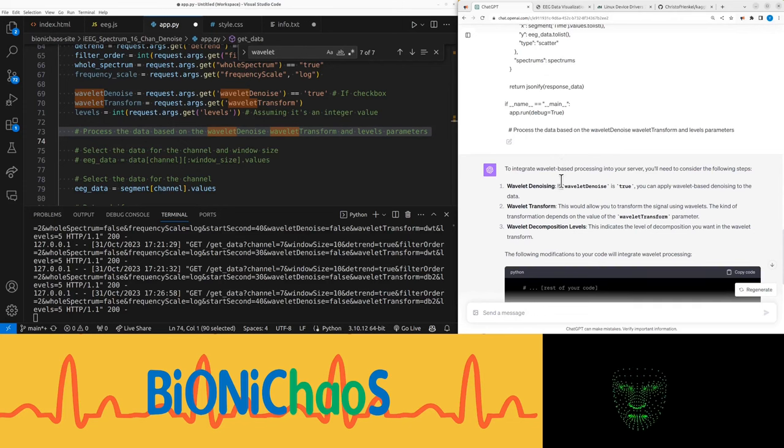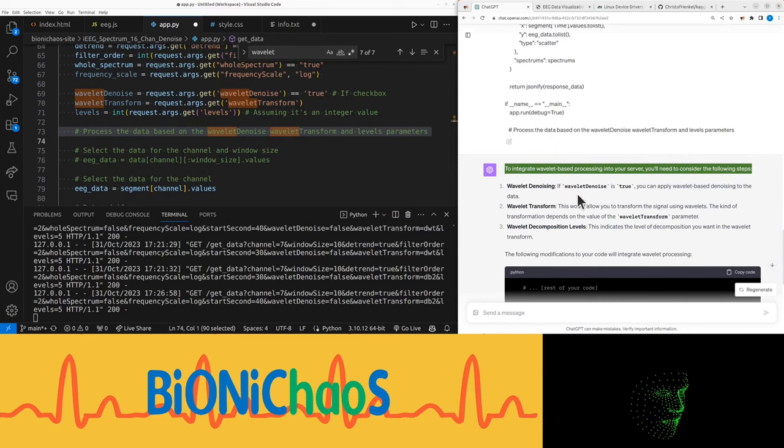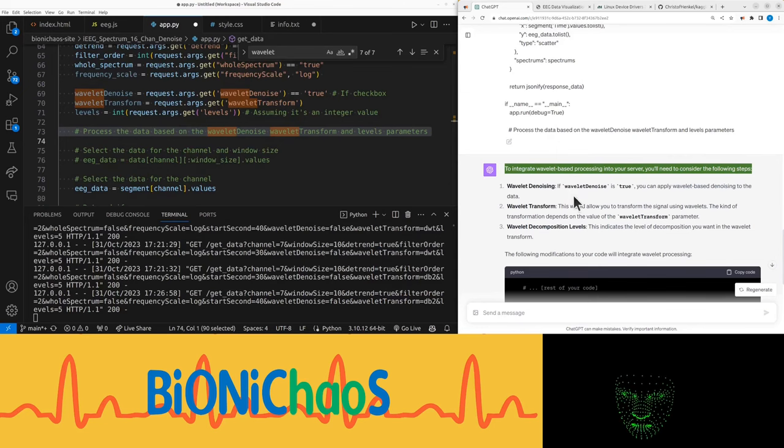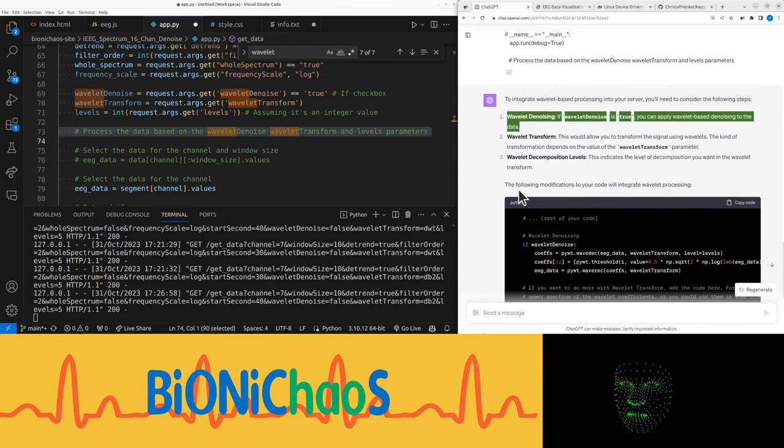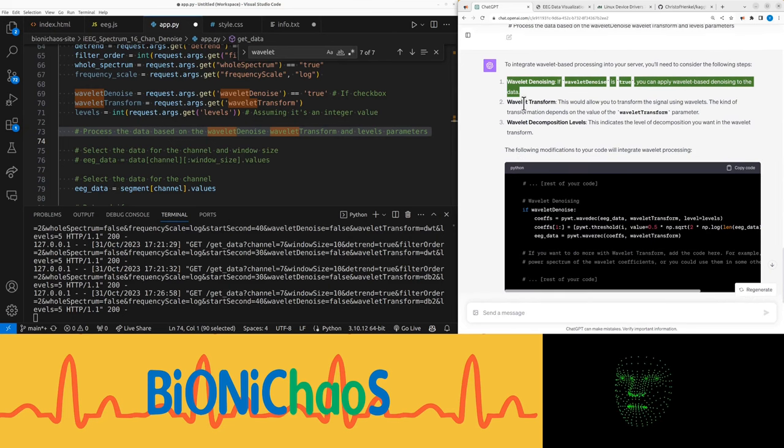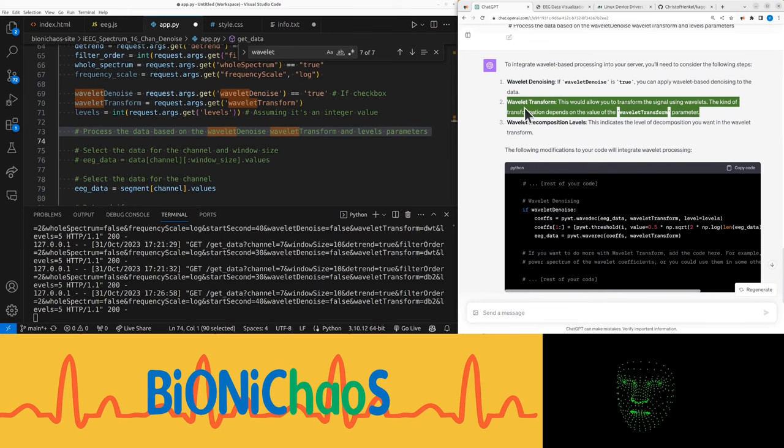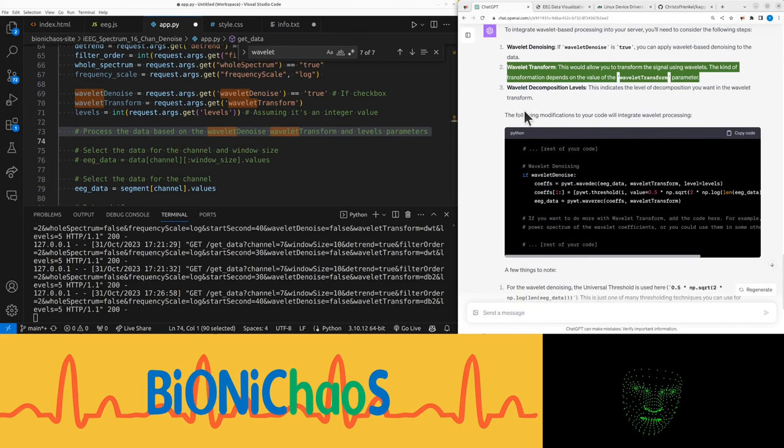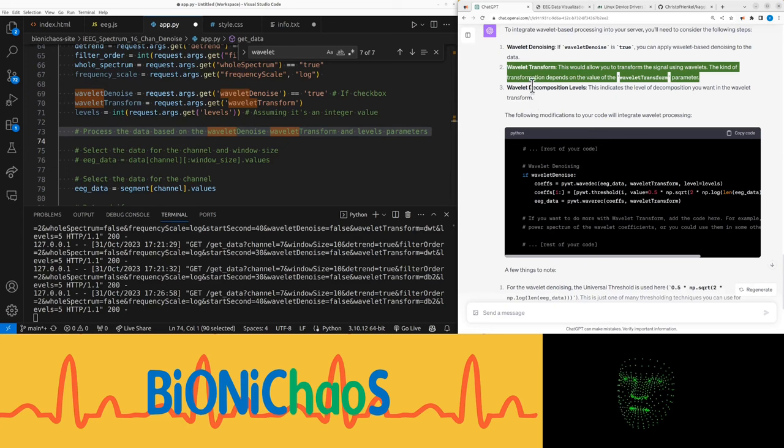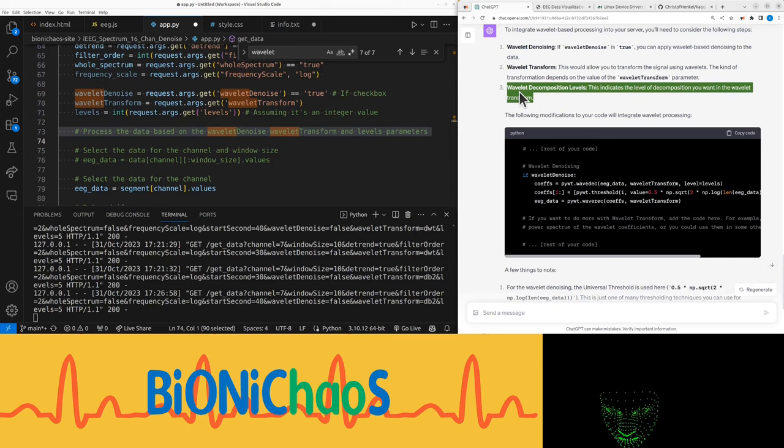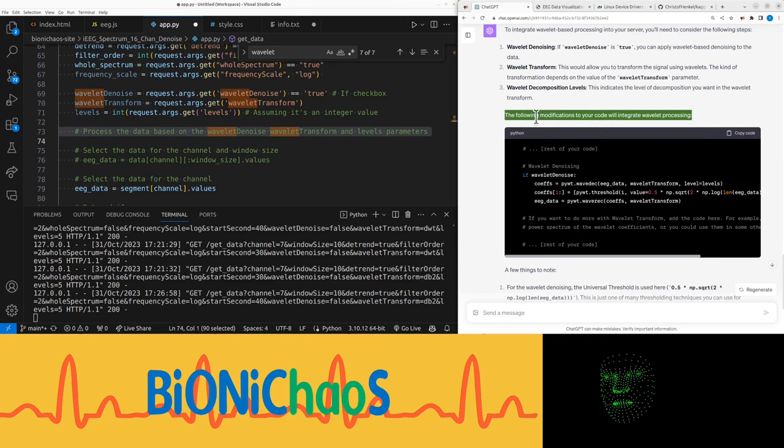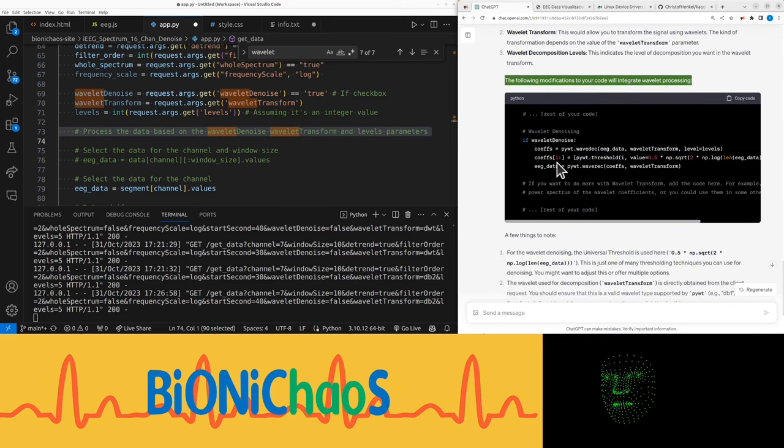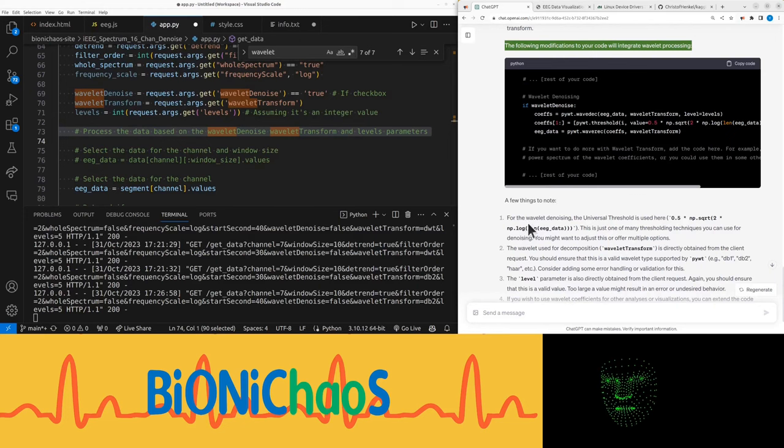Let's jump straight into it. To integrate wavelet-based processing into your server, you need to consider the following steps: wavelet denoising, wavelet transform, and wavelet decomposition levels. This indicates the level of decomposition. The following modifications to your code will integrate wavelet processing.